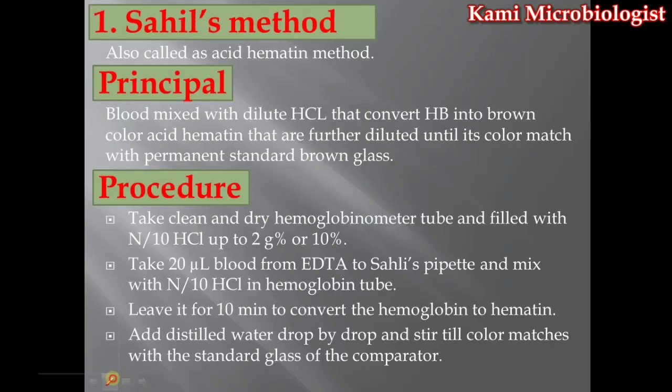Now first of all, let's explain Sahli's method, and how it is used to find out the hemoglobin concentration in the blood. Sahli's method, as the name indicates, was proposed by a scientist named Sahli.